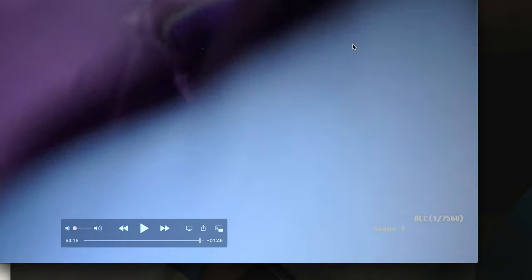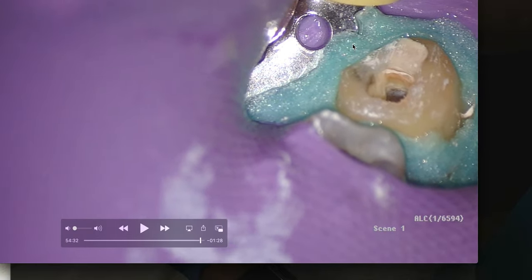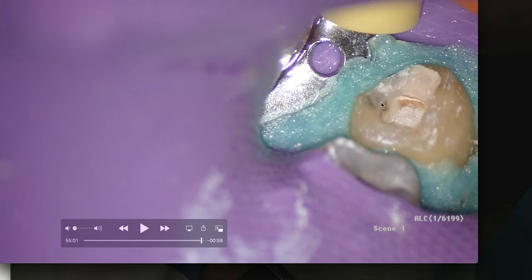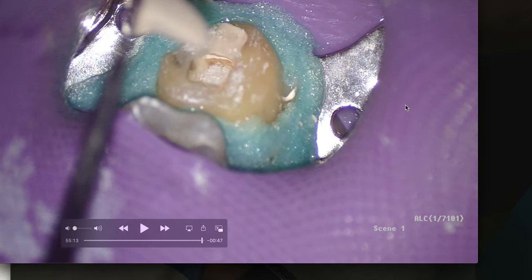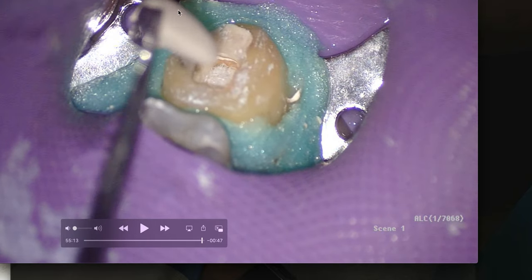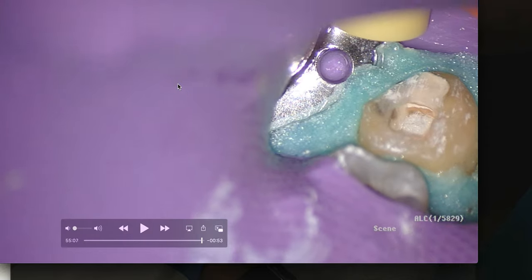Again, no middle mesial canal that I can tell. There's our distal — this was a little more difficult to get into. Place the cotton pellet, pack that down. It only needs a thin layer of Cavit since we're putting a temporary crown on. Take the rubber dam off, put the crown back on, and that's it. That turned out to be a little longer than I thought, but thank you so much for joining. Please leave comments about rubber dam clamps, endo tools you use, any questions — and we'll talk to you soon. Cheers.